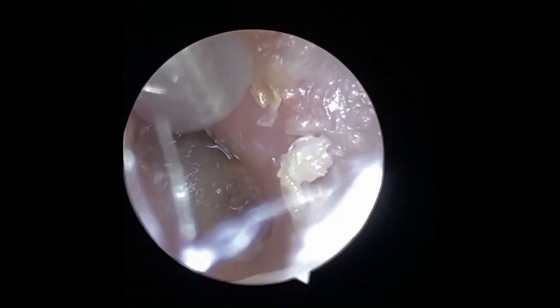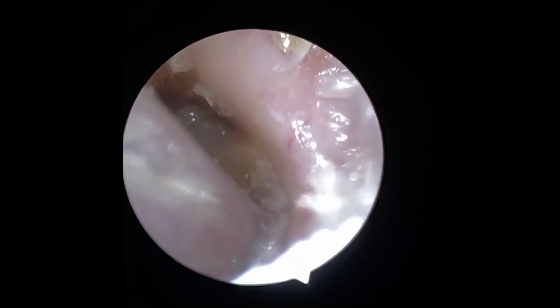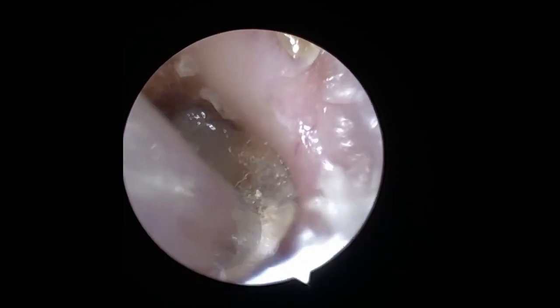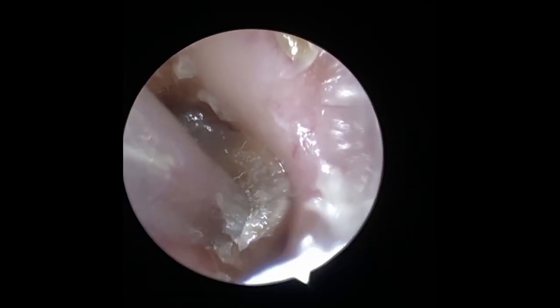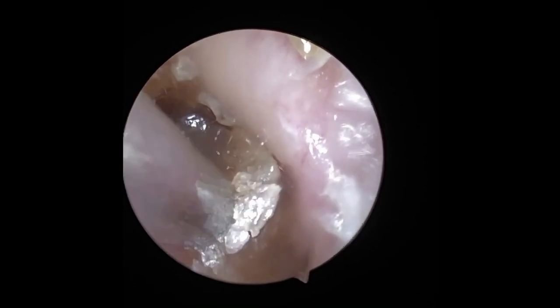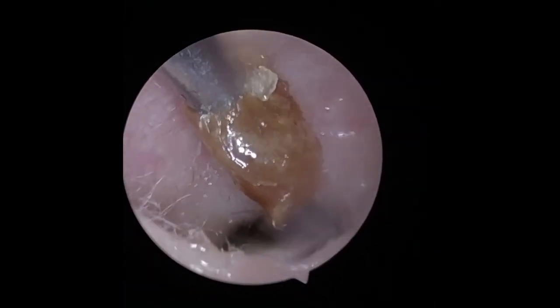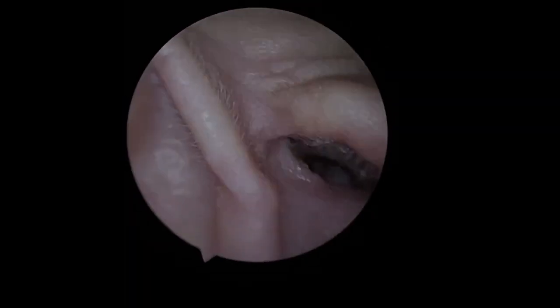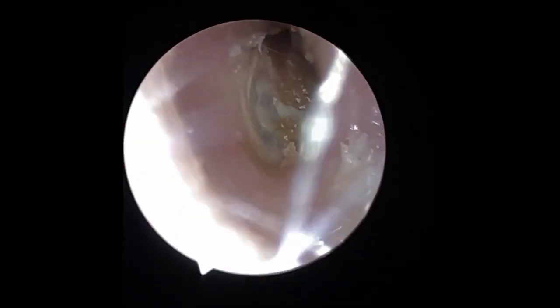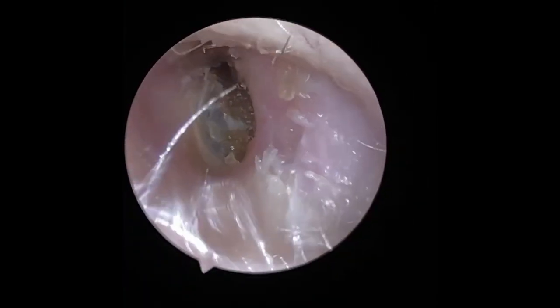There's still some skin remaining there. We're now going to tackle the main part of the blockage. So I'm going in — I've obviously already oiled — and we're very gently tugging away at the side of the wax, trying to keep it in one piece. As I'm suctioning, you can see that there are some silvery areas there on the edge, and that's just keratin layers that are coming away. That's quite a large blockage that has come away there. Now I'm going back in because I really want to see what's going on, and I can see that the eardrum is now partially visible.